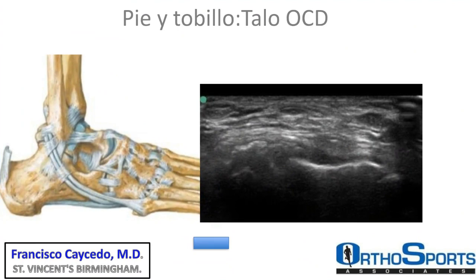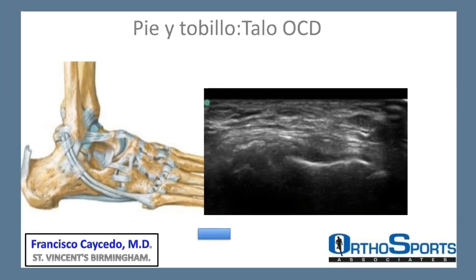One other pathology, you can see the osteochondral lesion of the talus. In these patients, you can see the fluid is increasing. The beautiful pattern is not there anymore, and you can see like a little bite. That means there is damage of the osteochondral surface in the talus. So it's impressive. You can see the osteochondral lesions when they have involvement of the osteochondral bone in the talus.